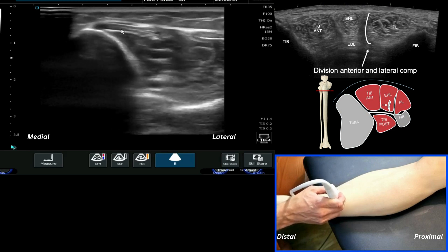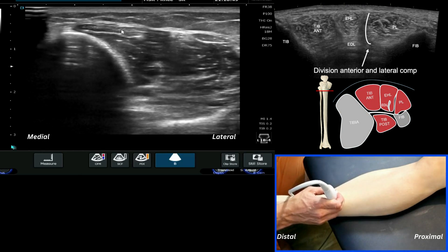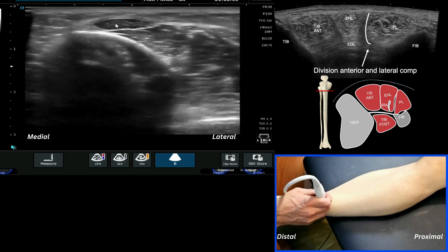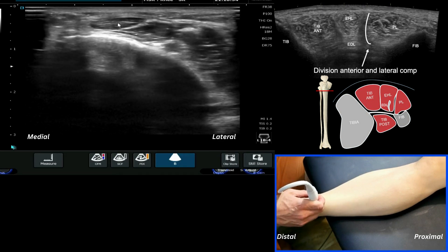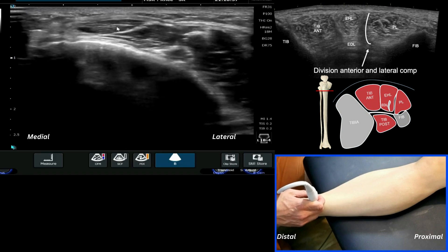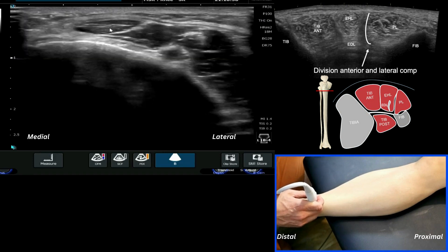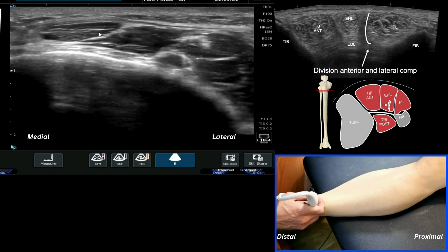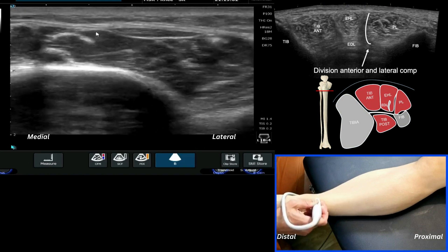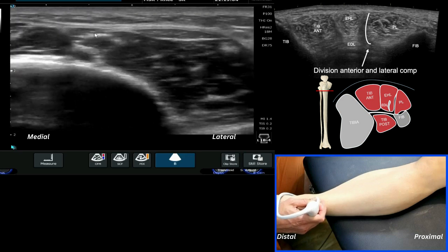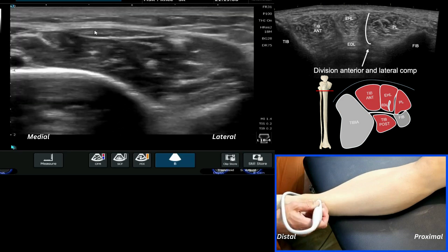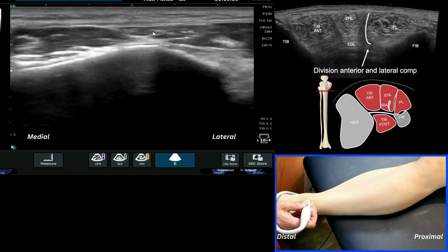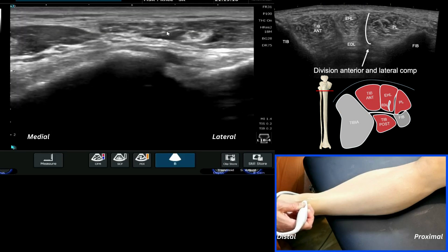Coming back to short axis and following it down, if we reduce our depth we see that very useful large soft tissue landmark at the front of the shin — your tibialis anterior — which you can see very clearly here. Adjacent to that is EHL, and then further laterally we're starting to get the formation of the extensor digitorum.